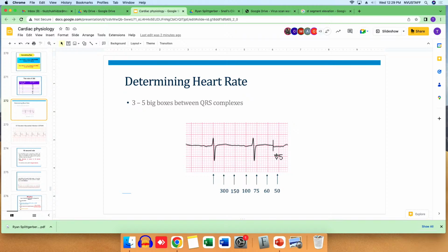Like this, you are seeing just a small strip, right? But in reality you are getting the whole roll of the ECG paper. So you are choosing the one quadrant which is always closer to the isoelectric line, okay?